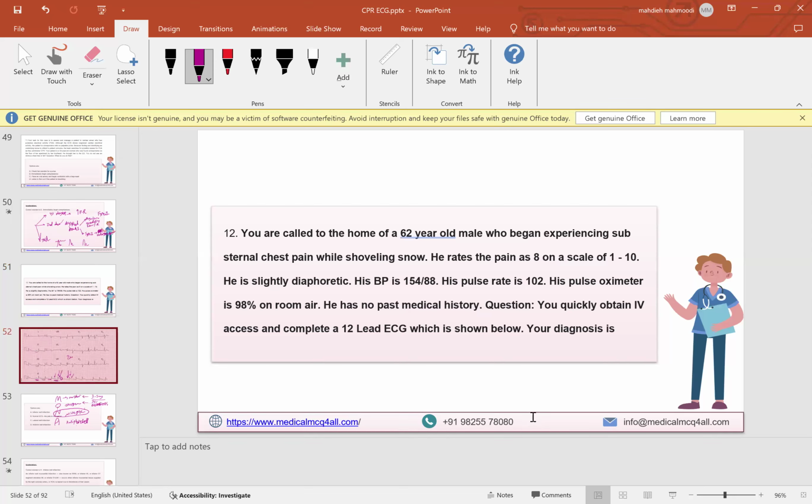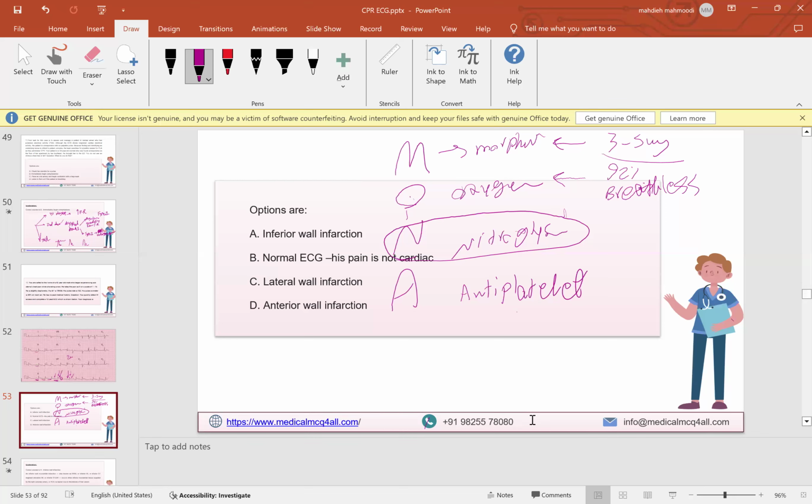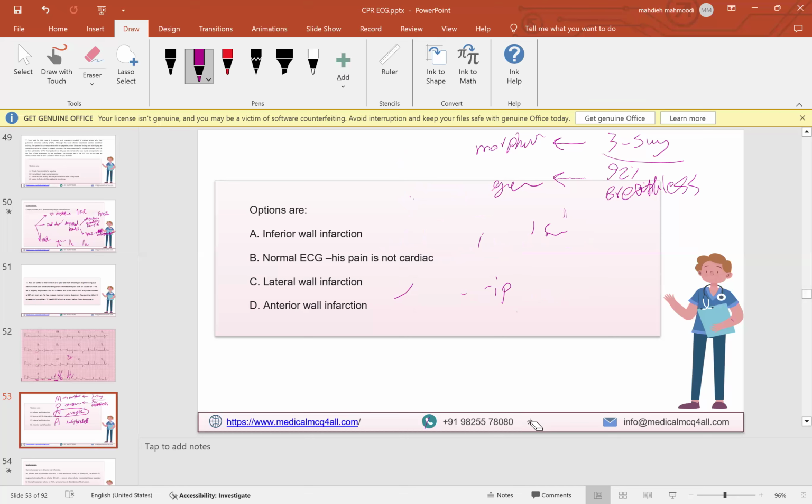Yeah, yes. What's the PR? The patient is talking to you. Only for prophylaxis can we put in temporary pacing, followed by thrombolysis or PCI. Because the inferior wall is always, maximum of the time, associated with blocks. And once after the revascularization, it reverts to the normal rhythm. So here's the thing, there is no need of treatment. In inferior MI, the right coronary artery supplies the SA node also.